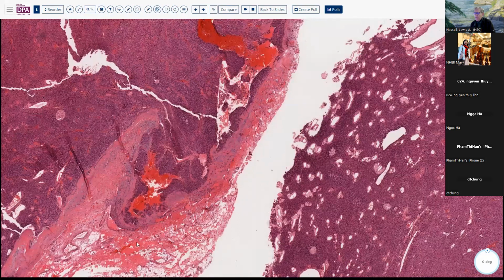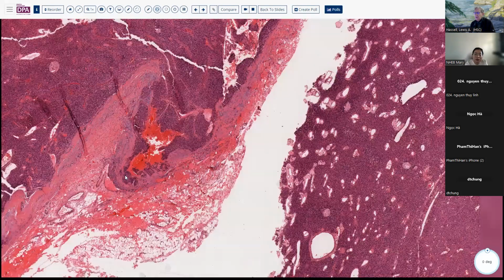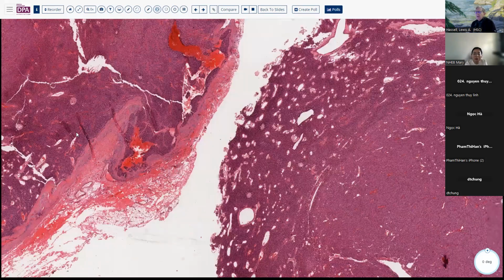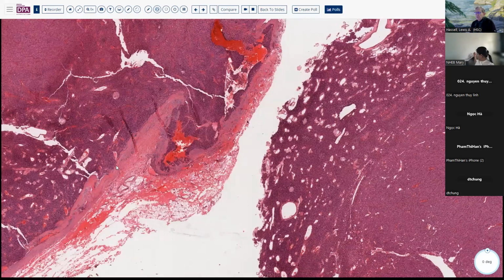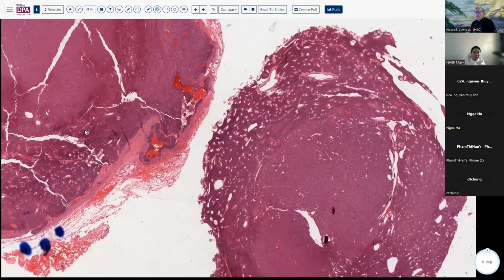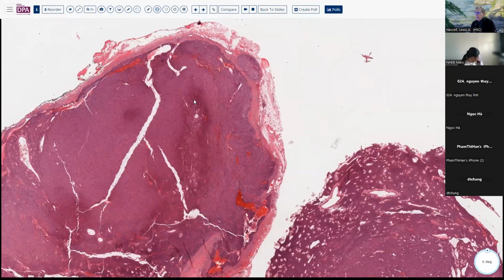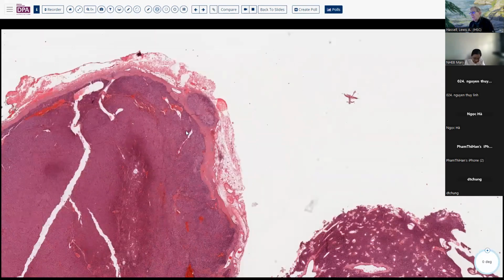And as well, we have what looks like it might be a vessel here. Certainly this is a vessel. So if you get a situation like this, and you don't see definite vascular invasion, but you're concerned about that, it would be good to possibly do levels, or to make sure that you had totally embedded the tumor so that you can look for any other evidence of malignancy.